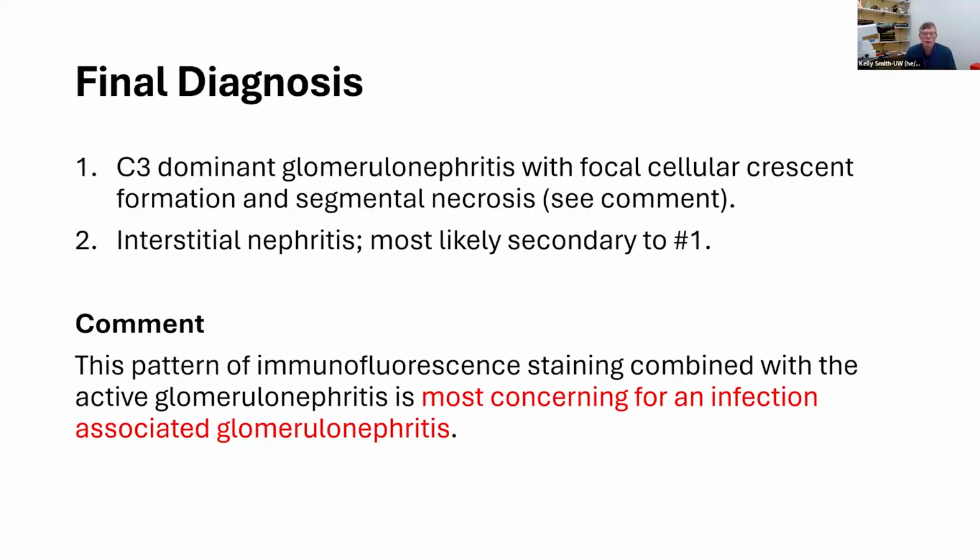So then our pathologic diagnosis, C3 dominant glomerulonephritis with focal cellular crescent formation and segmental necrosis, and that the pattern being C3 dominant is most concerning for an infection-associated glomerulonephritis.